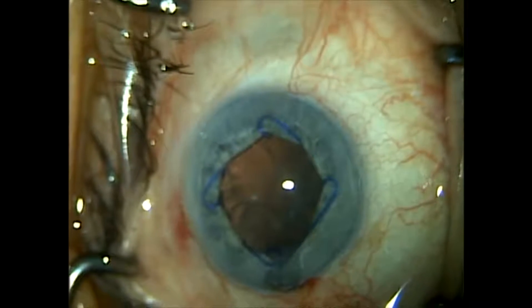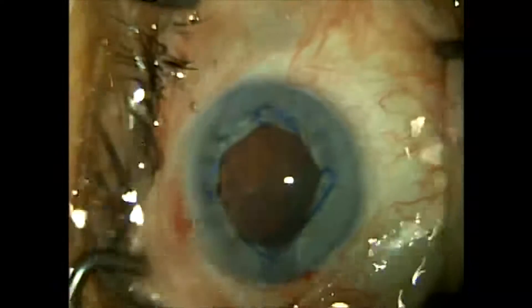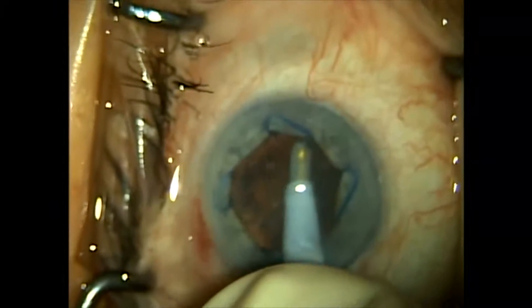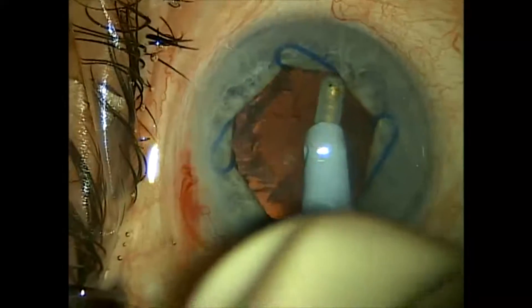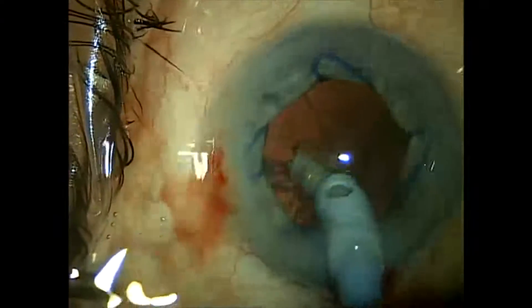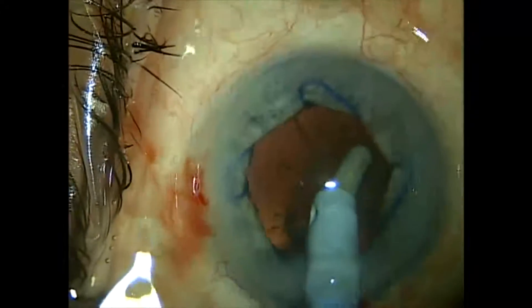There's our iris coming out due to the IFIS reaction — it's no big deal. We've got our Malyugin ring holding and supporting the pupil. We introduce our IA instrument made with a silicone tip sleeve by MST Microsurgical. This is where the Malyugin ring really pays off, because it makes getting rid of the equatorial cortex very easy and forgiving — it makes a complex situation very familiar and very simple.